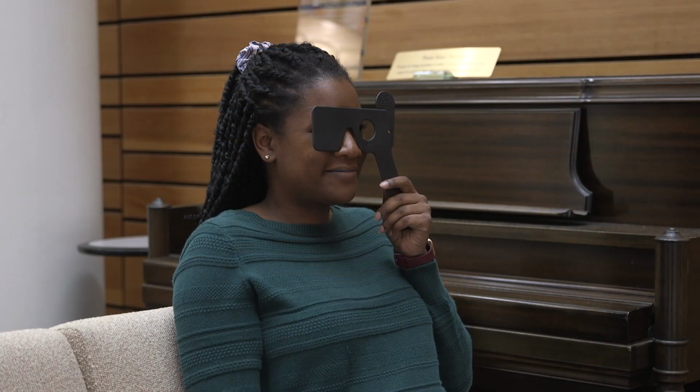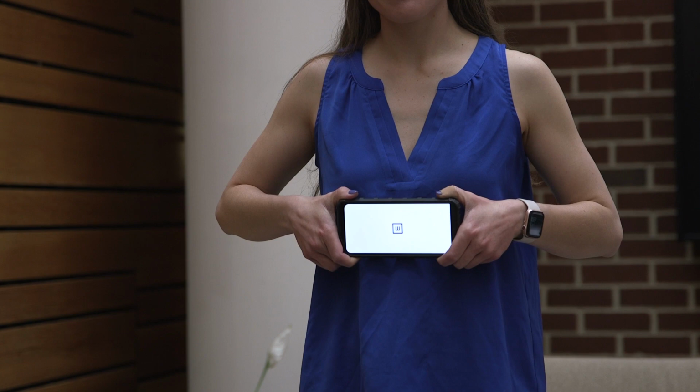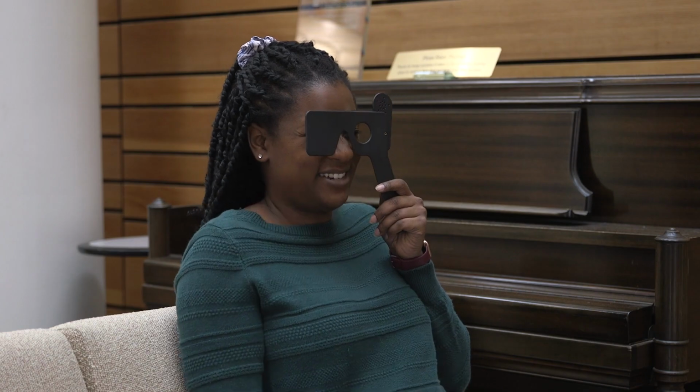If the participant cannot make out which direction the E is facing, you should skip that E by shaking the phone. You will hear this noise when you have successfully skipped that E. When you show the participant the next E, prompt them to try again to tell you which direction it is facing.